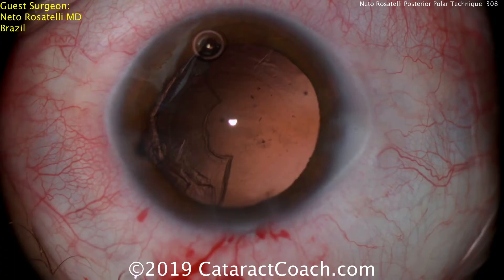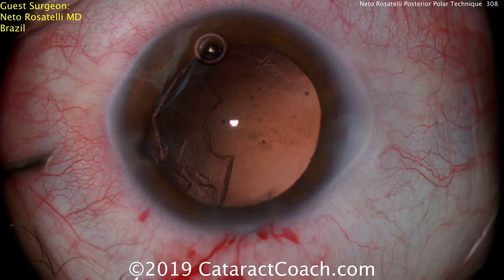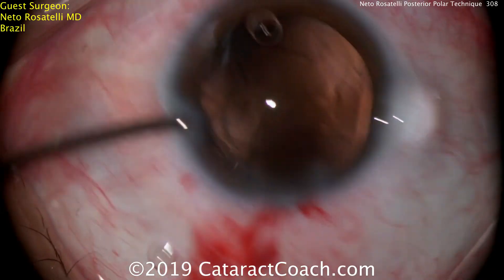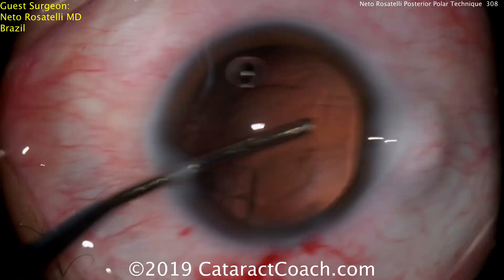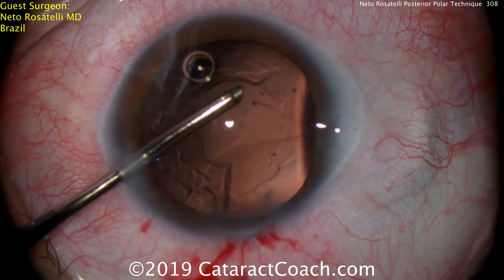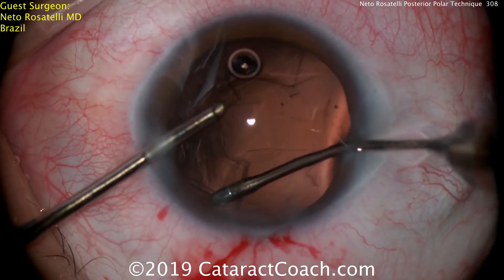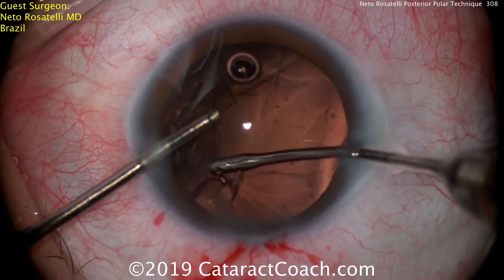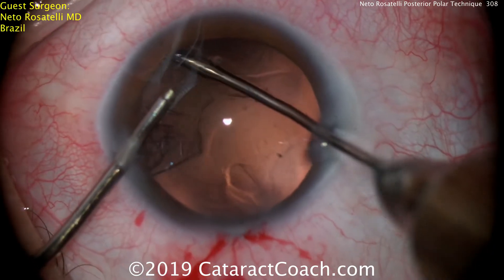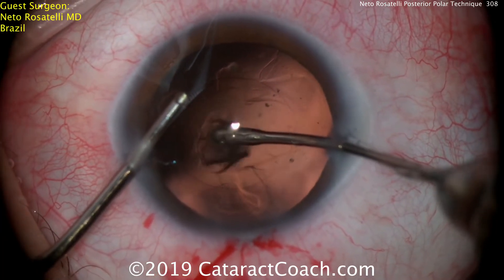Again, very important — don't let the anterior chamber collapse in a posterior polar case. So now the infusion goes in, and then in the right hand, the aspirator, and the rest of that cortex can be removed. In this case, the posterior polar opacity is completely removed and it looks great — the capsule is totally clean in the central posterior part. But if there is still some material adherent at the central posterior capsule, my advice is to leave it alone and do a YAG laser a month or two later.